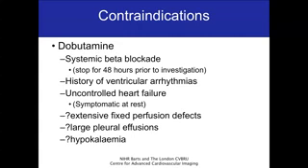That might also be an appropriate question. History of ventricular arrhythmias, uncontrolled heart failure, and then again with these question marks. So basically, if patients are pretty unwell, then you might want to be a bit careful with the dobutamine in a magnet. Hypokalemia, clearly, because it can increase your risk of malignant arrhythmias.